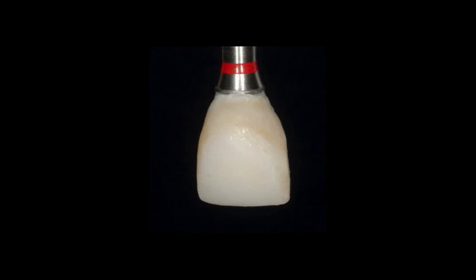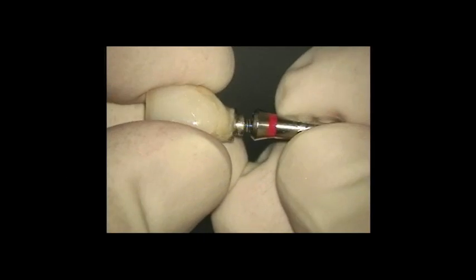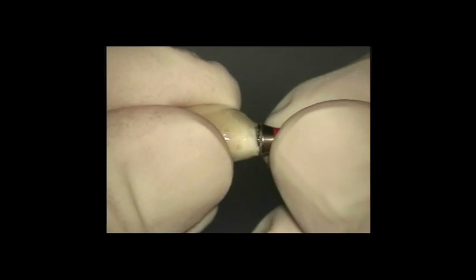Basically, we take the provisional crown, we screw it onto an implant analog. So here I am screwing it onto the analog.